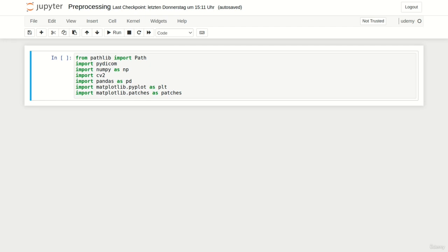Welcome back everyone. In this lecture we will pre-process the data for the cardiac detection task. The pre-processing pipeline is very similar to the previous one with the difference that we now have to somehow include the coordinates of the bounding boxes.